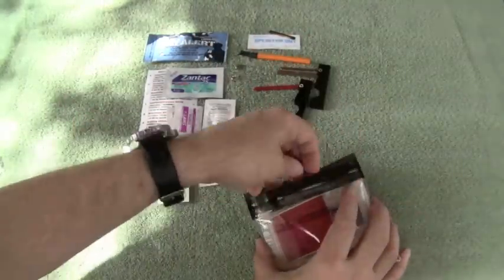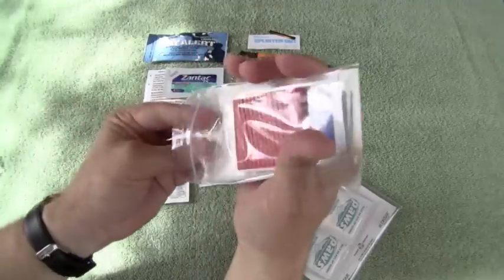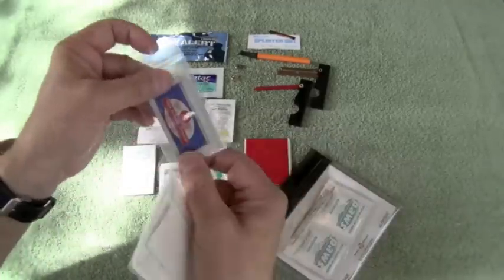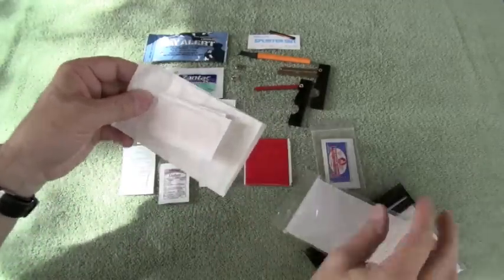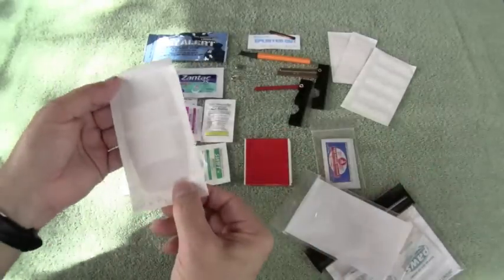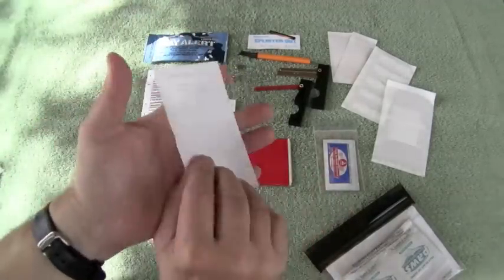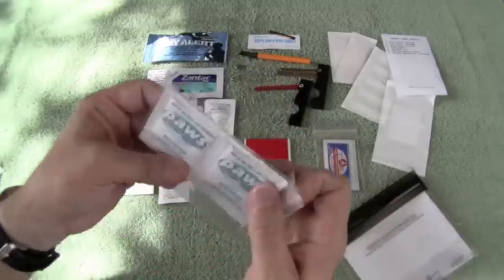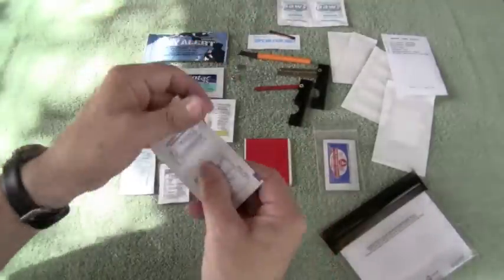This is the wound care module. Standard contents include a nice piece of two-inch duct tape, two packs of triple antibiotic ointment, two one-inch by three-inch bandages, five butterfly closures, and one two-by-four bandage. This module has a label printed on waterproof paper, giving you another piece of paper as an option. In a separate bag are two antimicrobial wipes and alcohol pads.